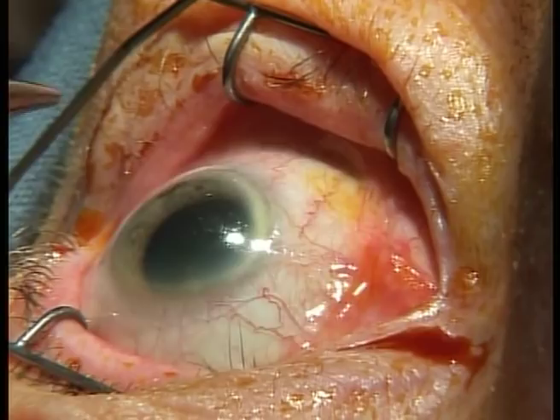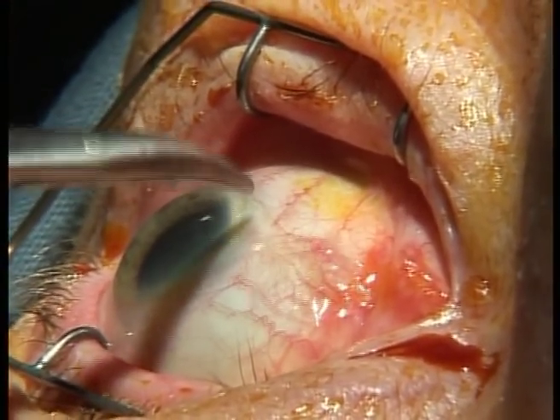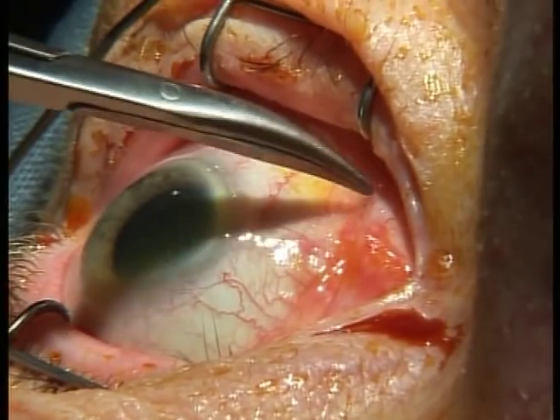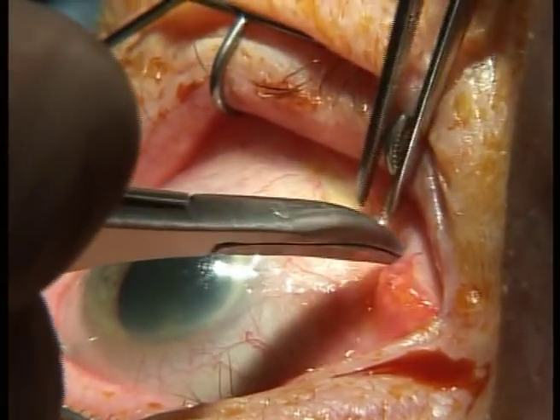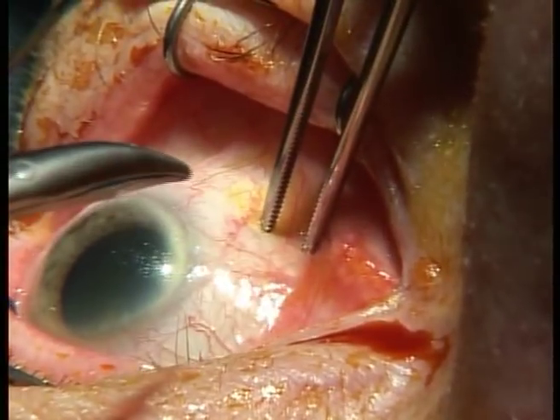George, look across towards me and up towards my shoulder. Try to get a reasonable distance away from the limbus so that any redness from your cut is going to be covered by the bottom eyelid. Don't get so far away from the limbus that you get into this fatty tissue of the bottom eyelid because that will cause a lot of bleeding. So here I'll just get down about there. There is a blood vessel there. I'll try and move away from that.